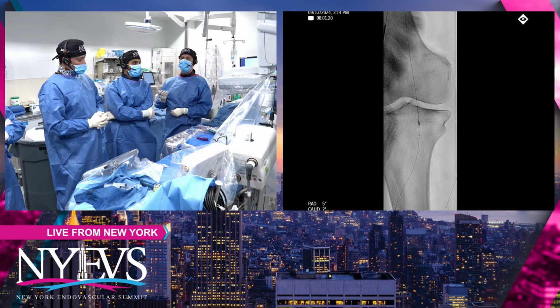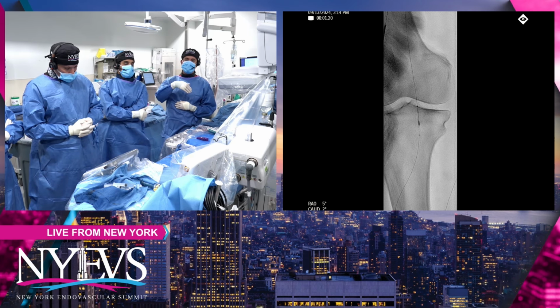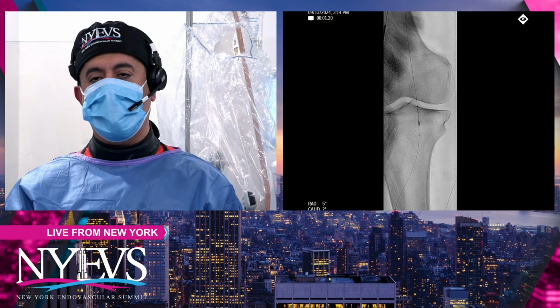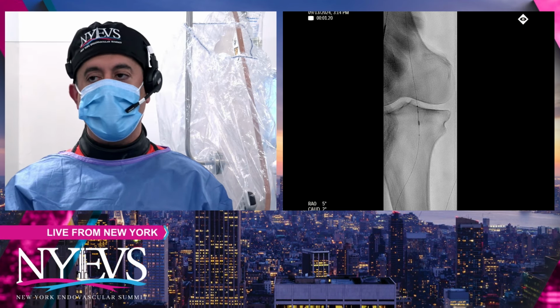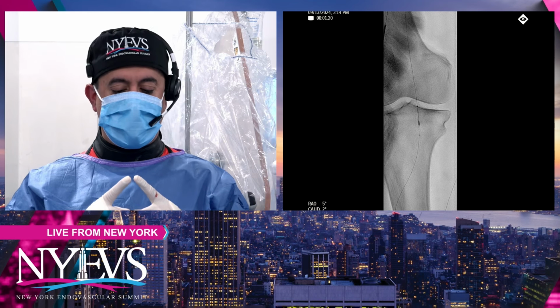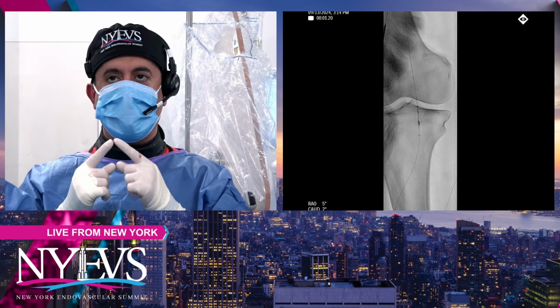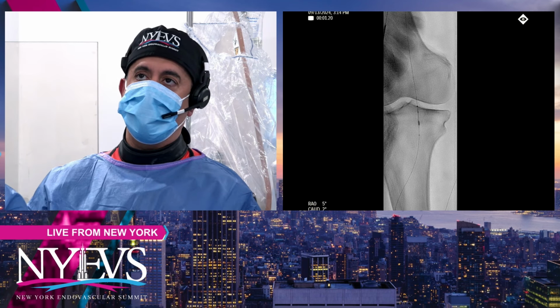Right, now we agree. So usually what we try to do is we want to give the sheath some body. So we keep our stiff 035 wire, we reintroduce the dilator, so at least the sheath has some body to it, and then we slowly pull back, of course, keeping in mind that we're not going to cause any damage, elongation, or crushing of the edge of the stent. If you really look at the iliac kissing stents, there is a little bit of room right at the ostium, so the struts are not really protruding into each other, which gives a little bit more flexibility. But like I said, we were very careful in going up and over.